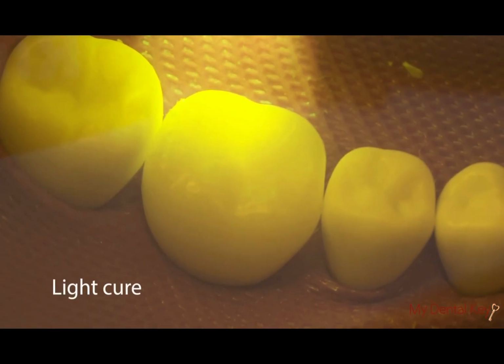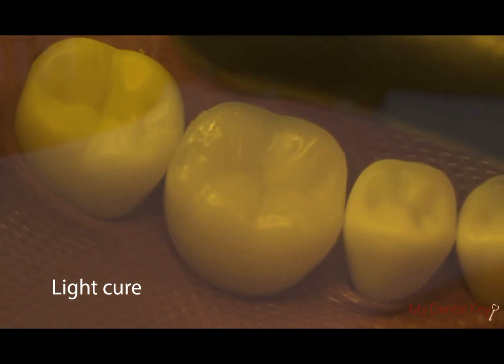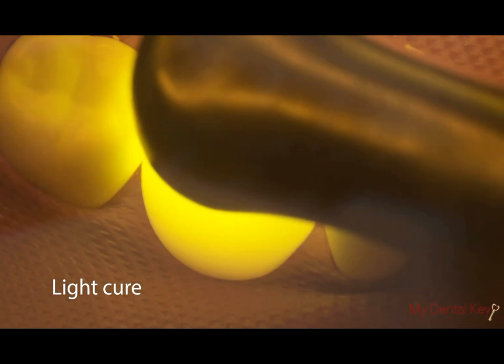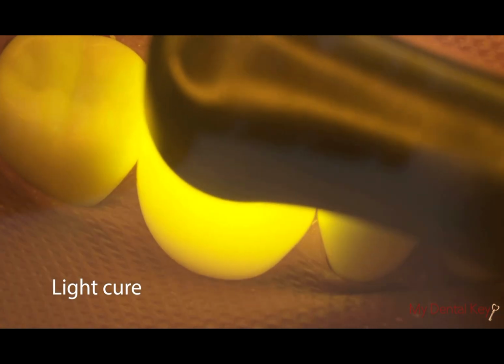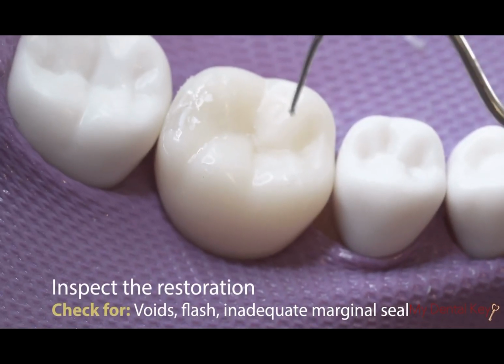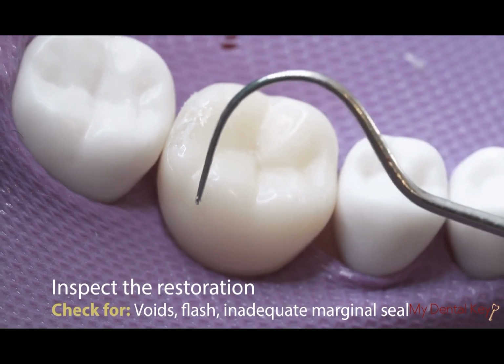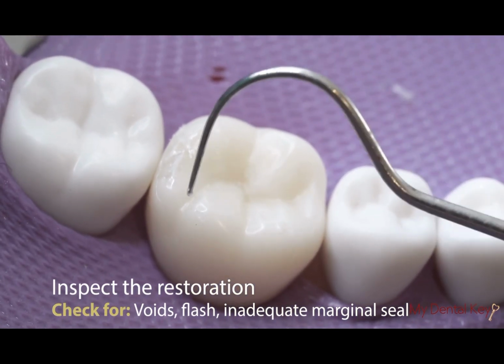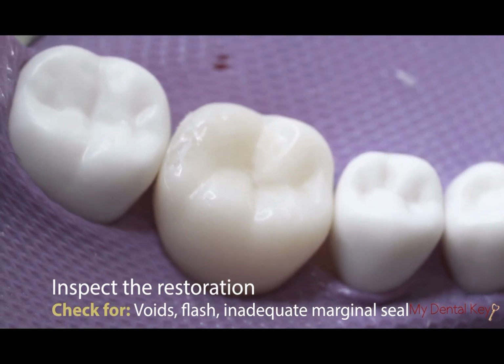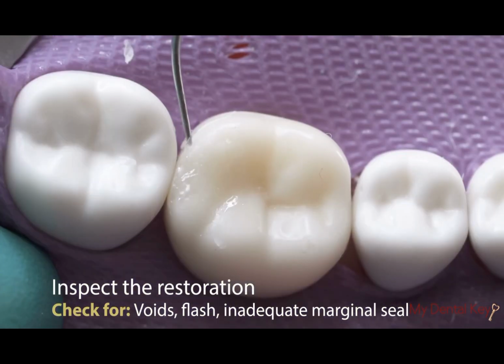After removing the assembly, light cure for 20 to 40 seconds from the lingual, buccal, and occlusal directions. Doing so will help cure any areas that were previously protected by the assembly complex. Take a moment to inspect the restorations for voids, flash, and inadequate marginal seal. Add composite as needed. We're doing a lot of inspections here, but this is an important exam, so we just want to make sure that we don't miss any steps.